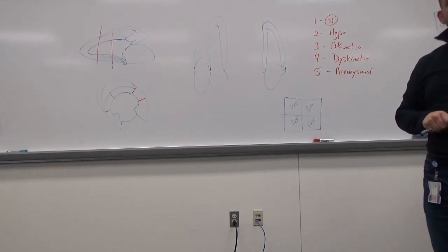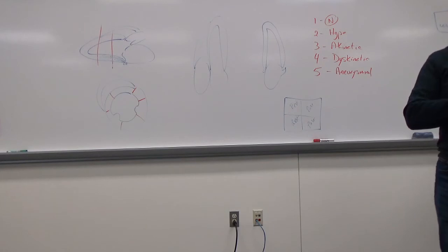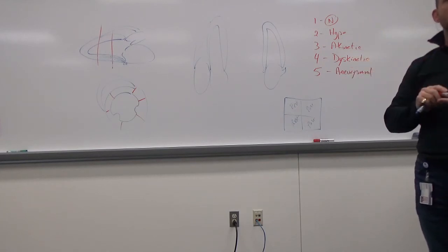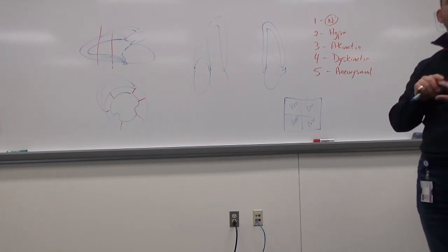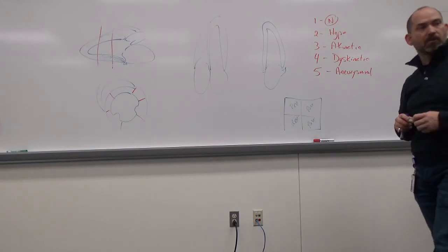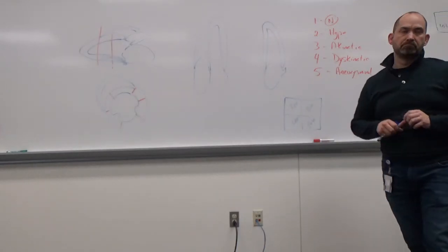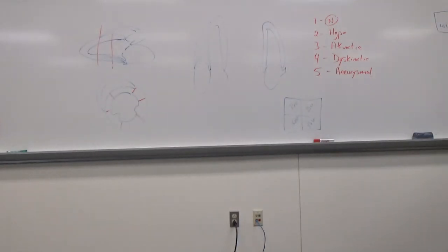So Doppler can be done after the fact. You can look through the textbook at the various types, but it's going to be basically diastolic stuff, so it's mitral inflow. You're probably not going to need Valsalva, but you could. Tissue Dopplers, you could do pulmonary veins, stuff like that. And I think that was the essence of that chapter.